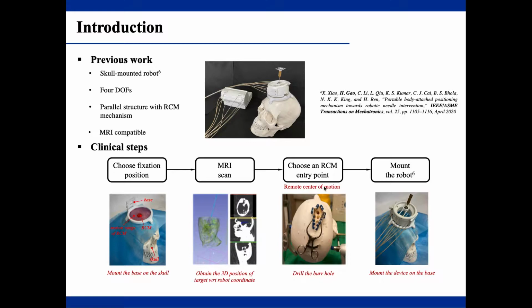It is the abbreviation of remote center of motion. Therefore, how to choose the RCM is highly associated with needle path planning. This process should satisfy several clinical and mechanical requirements.